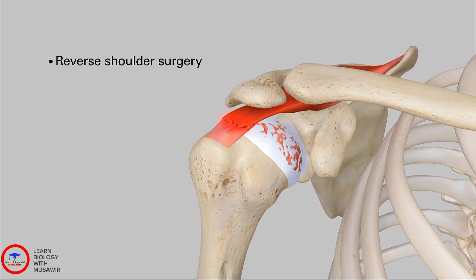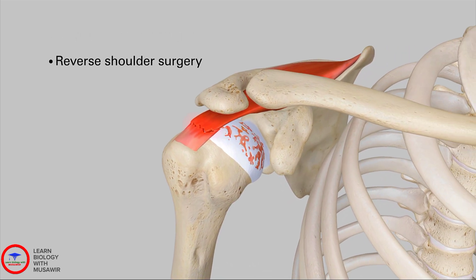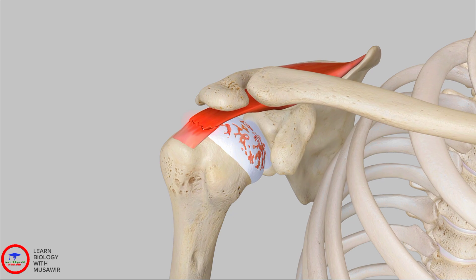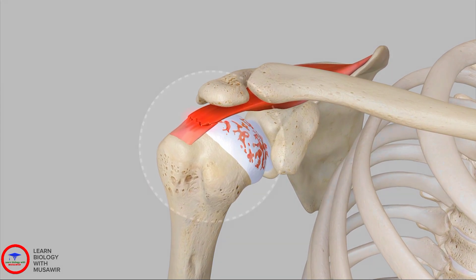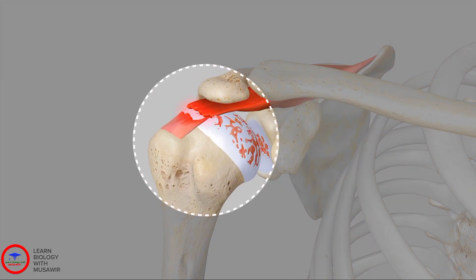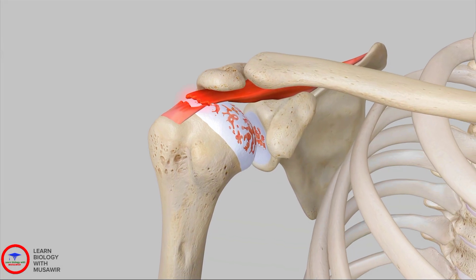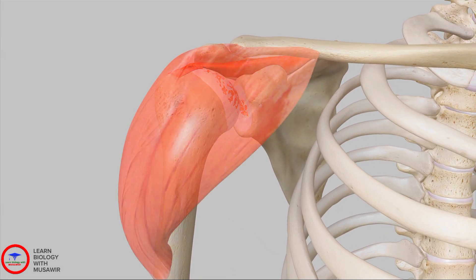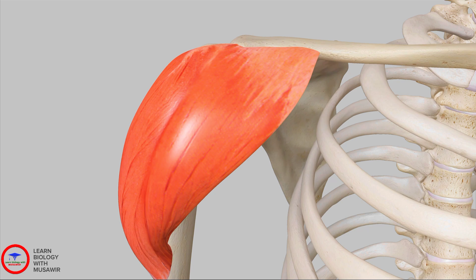A reverse shoulder procedure is needed when the patient has a massive, irreparable rotator cuff tear and arthritis. When the rotator cuff tears, the muscles lose their ability to keep the humerus centered on the glenoid, causing the humerus to move upward and out of the socket. In a reverse shoulder replacement surgery, the shoulder anatomy is reversed, allowing the deltoid to become the main functioning muscle in the absence of a healthy rotator cuff.